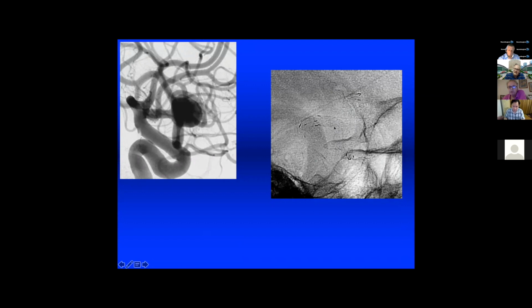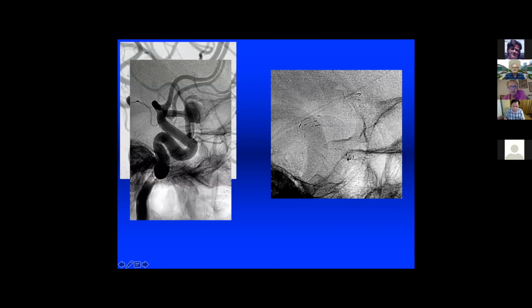But be careful also, because when you remove the guide wire, it's possible you get a kinking of the stent and close the branch. This is the reason why, when I put the stent, I wait 30 minutes to check if there is thrombus in the vessel.